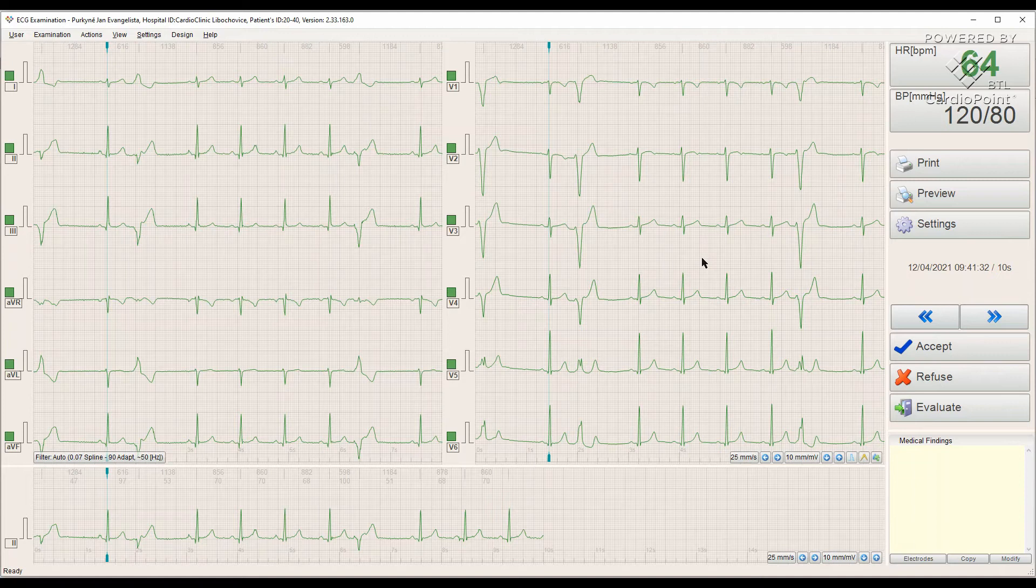Right now, we are satisfied with our recorded signal, so we click the Evaluate button.